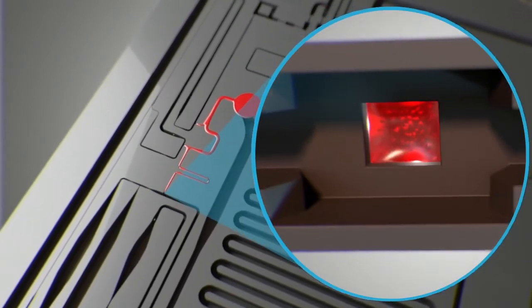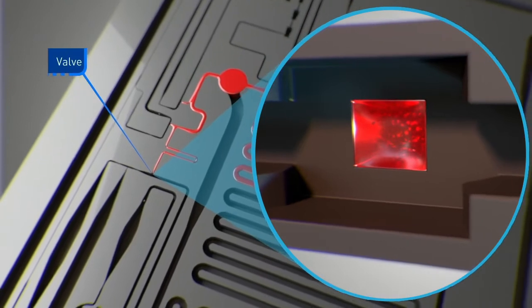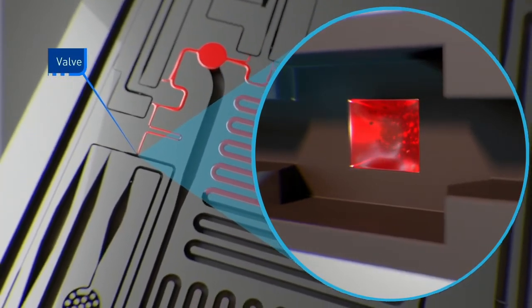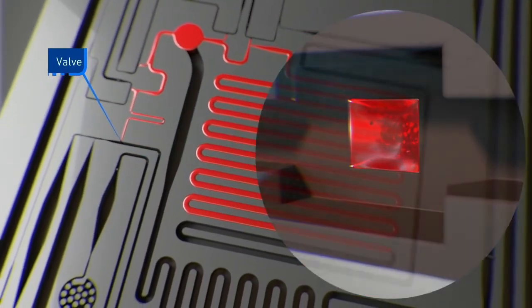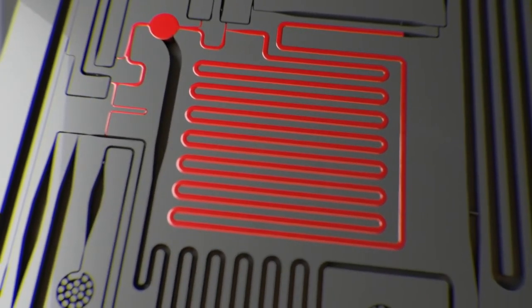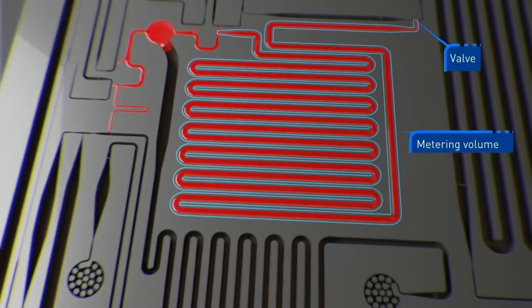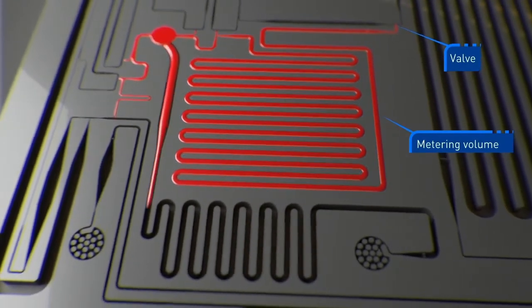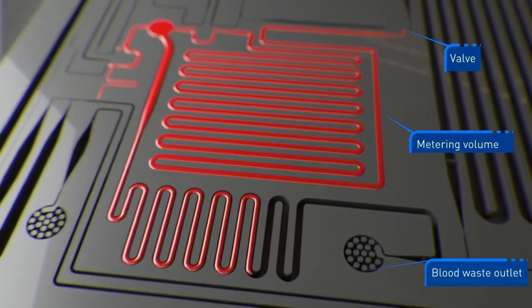The innovative design of the chip includes valves that purely function on capillary forces. These unique valves enable the sample to be temporarily held in a channel and measured to a specific volume with nanoliter precision, while any excess is siphoned off into a waste channel.